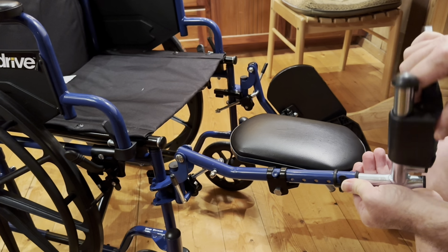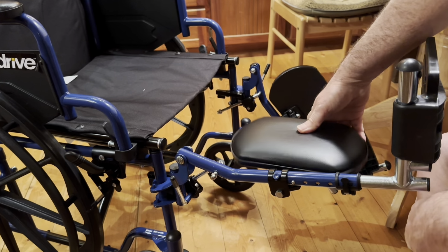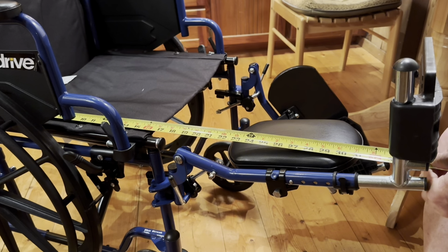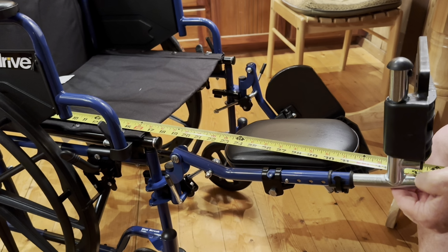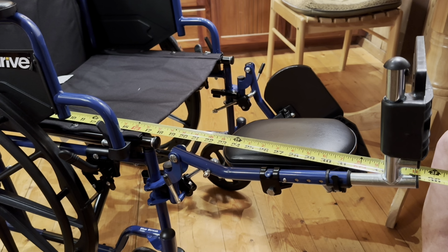Disappeared. Where did it go? There we go. Okay, so the button is now here, locked in. That's the shortest it can go. Let's measure that. So all the way from the back of the chair, where your back would be, to here, it's only 34.5 inches. Okay, so 34.5 inches at the shortest.